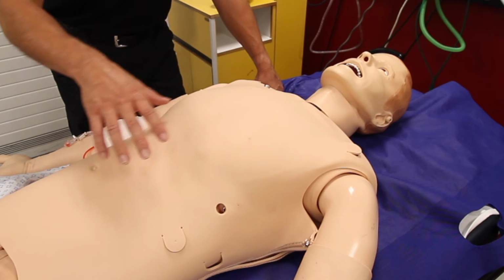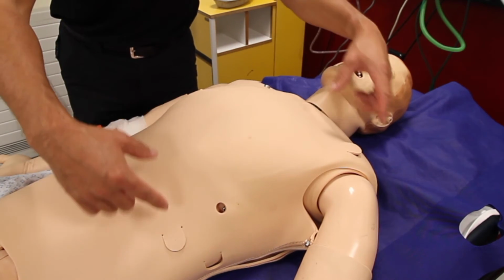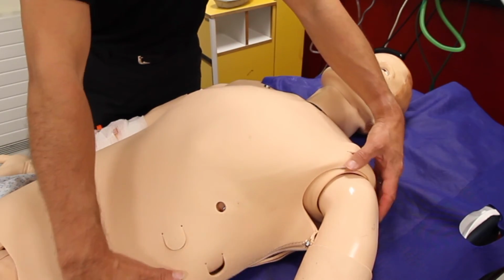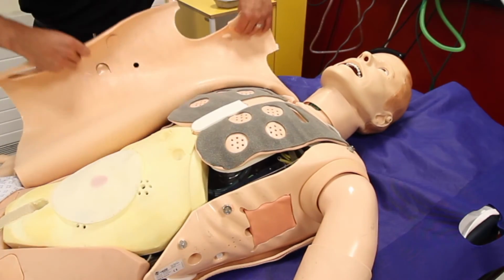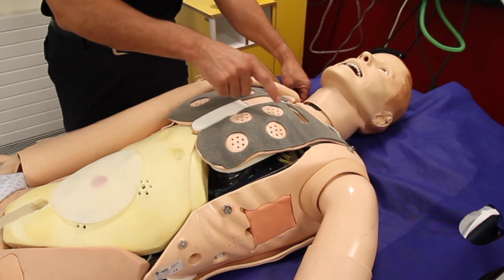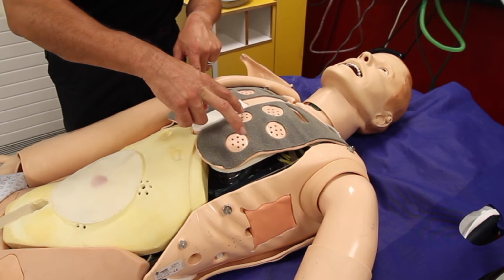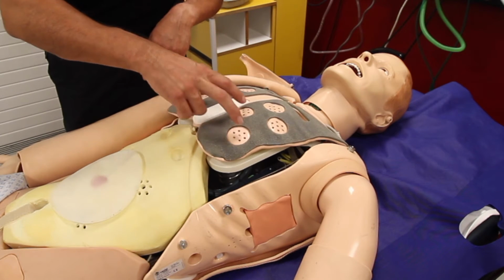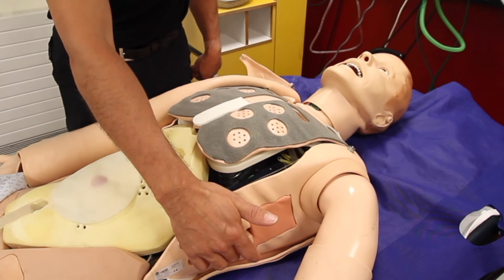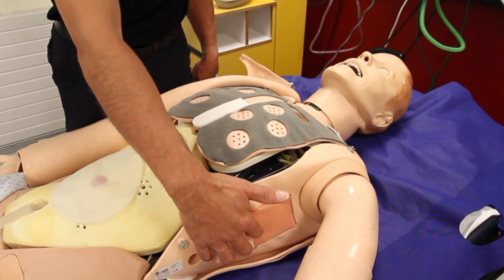So we talked about auscultation of his chest and where you might hear those chest sounds. So I'm just going to show you where those speakers are inside, so you get a clearer picture about where they correlate to the outside of his chest. So I'm just going to pop back his skin for a second here, and you can see that these speakers on his chest here generate the sounds that you hear. So generally speaking, these are heart sounds, and he's got some breath sounds, some more heart sounds here, but on this side here, these are a mixture of heart and breath sounds. And then just on the bases down here are his basal sounds. So you'll be able to hear his basal air entry in that side there.